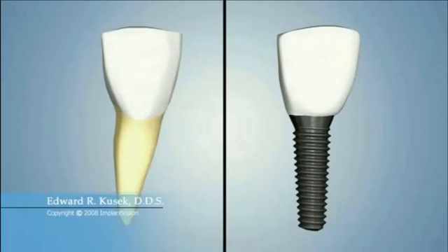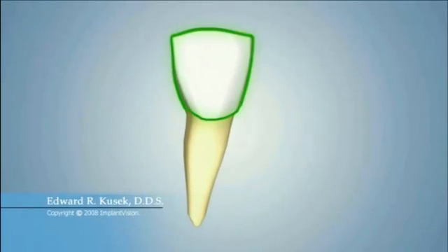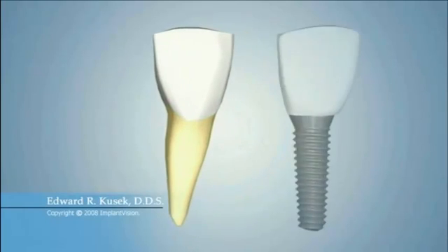A natural tooth is one piece commonly described as having two main parts. One part is the crown that sits above the gums. The second part is a root that sits securely in your jawbone.